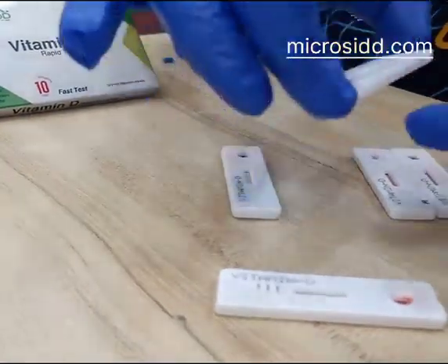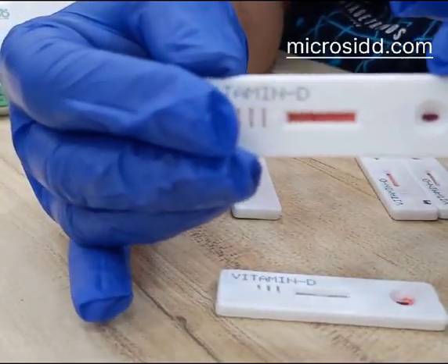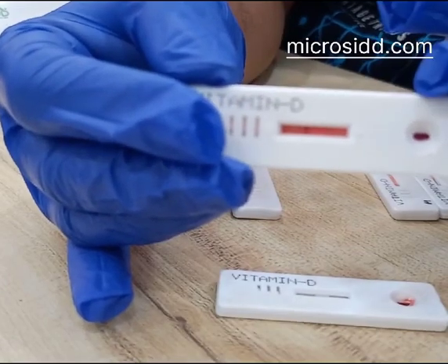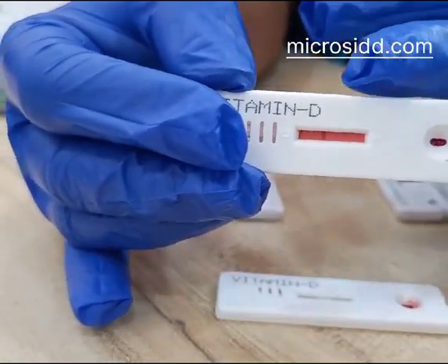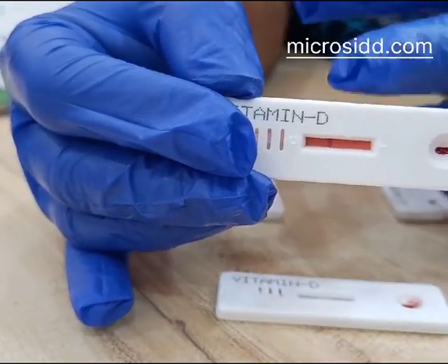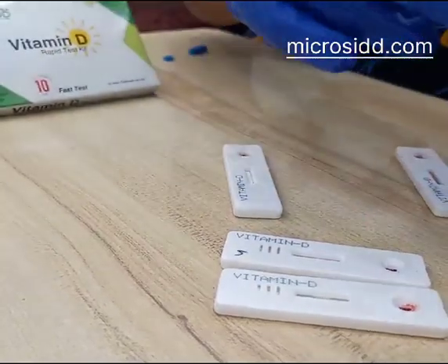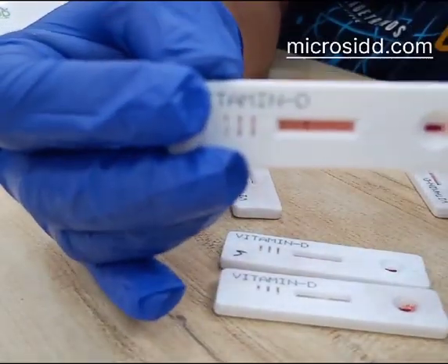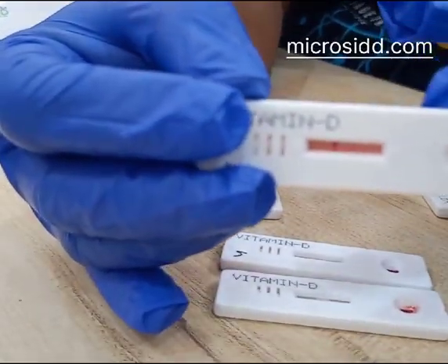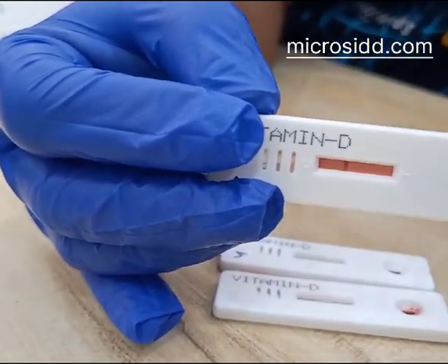In this case there was a slightly higher quantity of blood sample, that is why the background is red. Because of the high volume of blood sample the background is red, but the test is negative. Here also there was a slightly high number of sample but the test is negative and the background is slightly red.